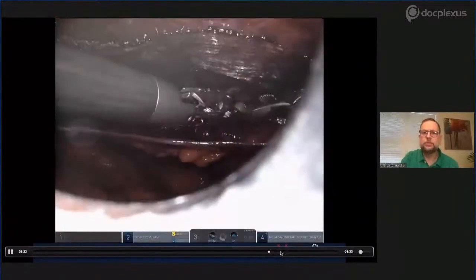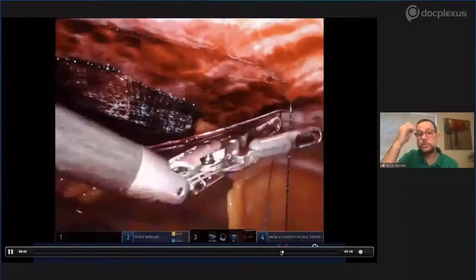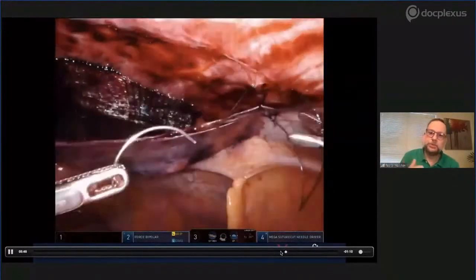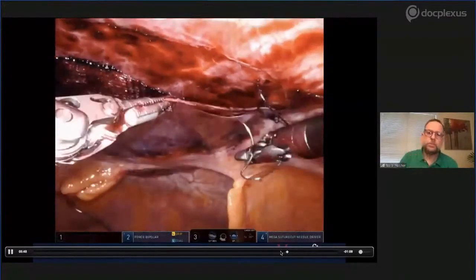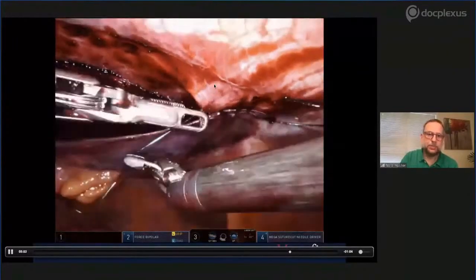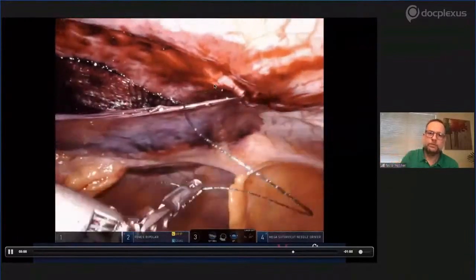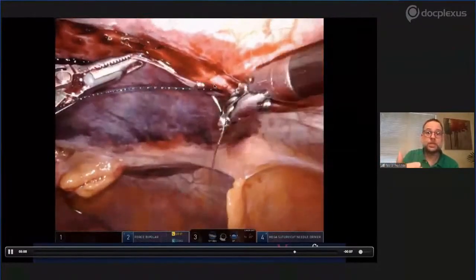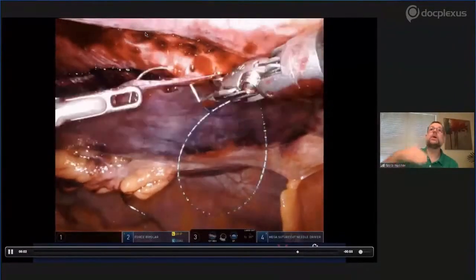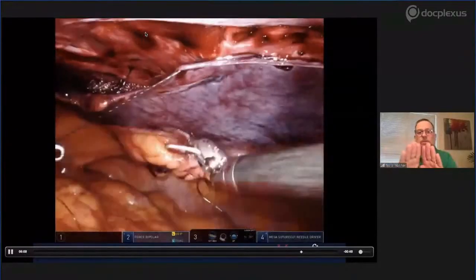And at the end, you just need to close your peritoneum. For me, when I try to do this by laparoscopy, this is the most difficult step. I just want to stress to you here, there are 2 options. You don't need to close the edge with the edge. You just need to close the space. So you can do it before the edge to avoid tension, or if your mesh is a little bit over the edge, you can suture the inferior lip superiorly to the upper lip. There's no issue. You don't need to do edge to edge.